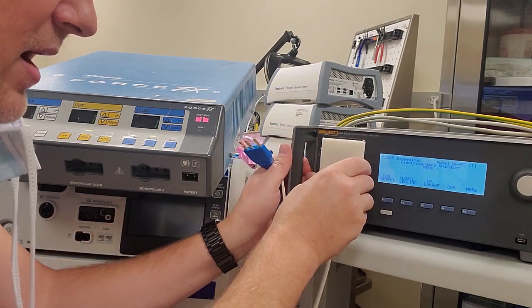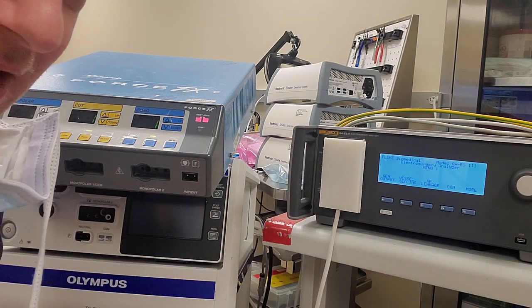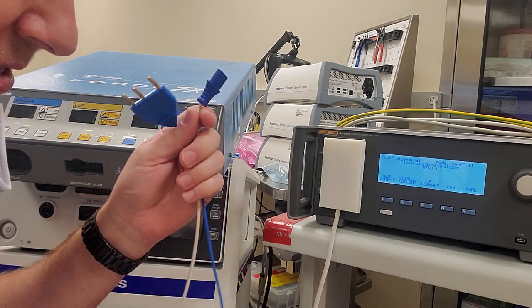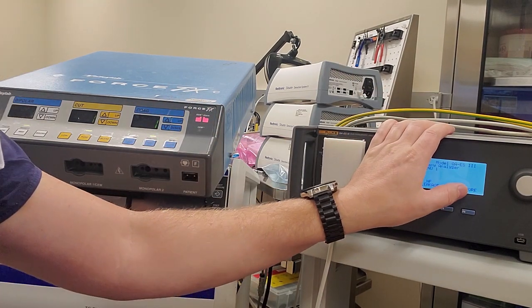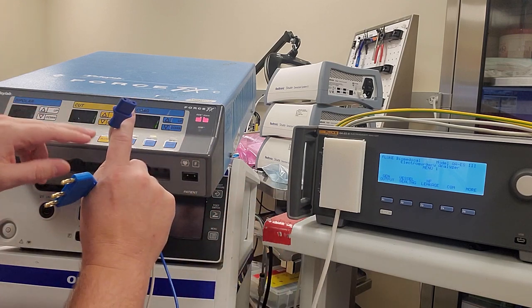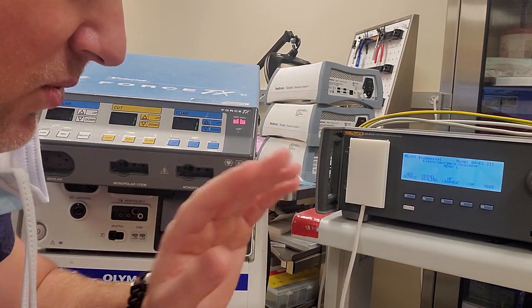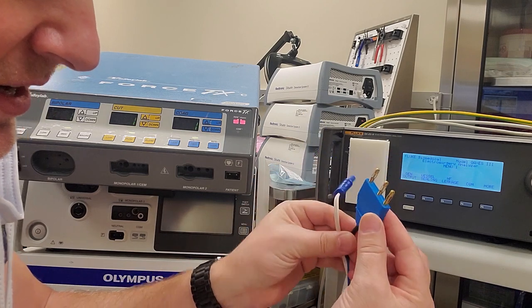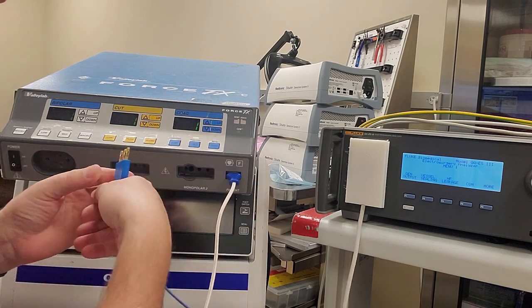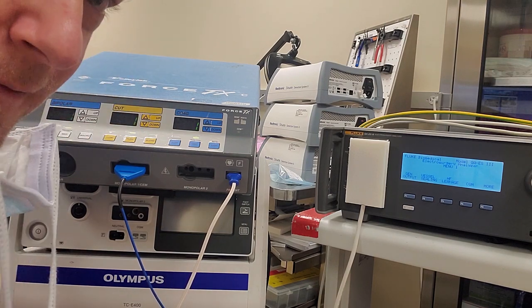I'm using this adapter plug so I don't have to use the foot control, and you guys are going to see why that is such a huge bonus with doing these calibrations — otherwise you're working your feet and both your hands, which is a bit much to coordinate. With this system you utilize the power of the QAES3, make it do the work and activate the ESU for you. All you have to do is adjust the Valleylab and get it back within spec. My setup has just two leads: your monopolar and your patient return.